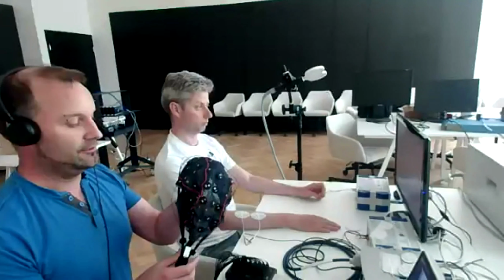The others, like the Scarabeo electrodes that we also have, have a little bit of a gel reservoir because there is the holder ring that we are using. In this case, you simply have a bigger area, but as these are so flat, there is almost nothing here. But the principle is the same. With the tip, you try to reach the skin again and fill it up a bit so that you see the gel coming out slightly on the top.